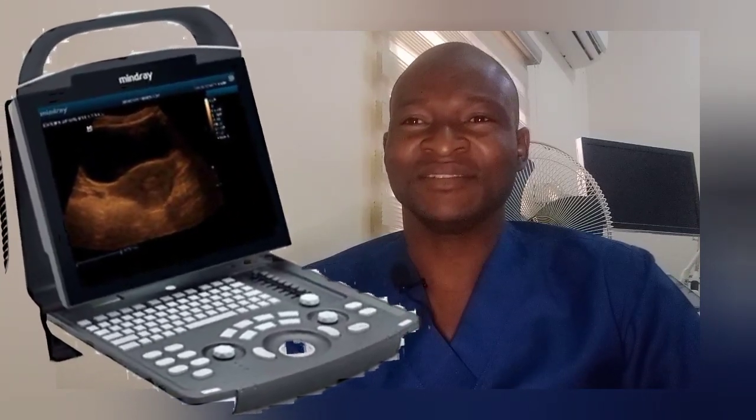Most modern systems are using digital display and recording devices such as LCD display, picture archiving and communication system (PACS), or other digital storage like magneto-optic discs: CD-ROM, DVD, Blu-ray, pen drive, and so on. In these systems, the DAC is not required because they are already digital. So digital storage maintains the advantage of a digital system and allows most processing, measurement, and all other functions to be applied to the stored image in system memory.